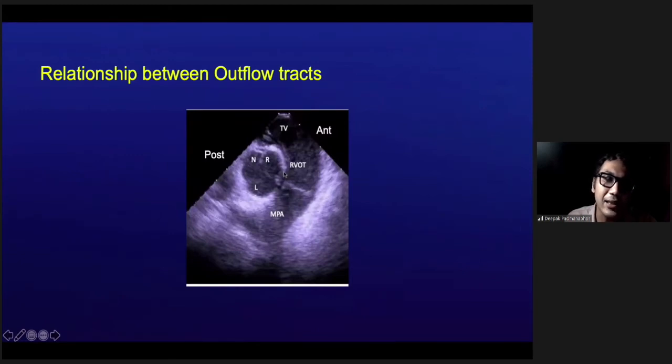Slight differences exist, but more or less they are either exiting on one side here or on this side here, if the focus is in between. The characteristic anterior RVOT is right up here. The posterior RVOT or anterior right ventricular, anterior right sinus of Valsalva, and then the left coronary sinus of Valsalva, followed by the mitral annulus, which will be here.